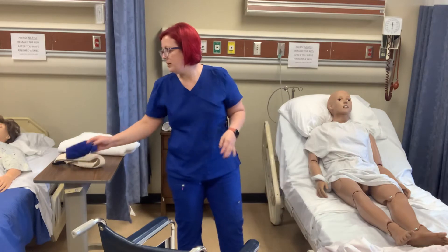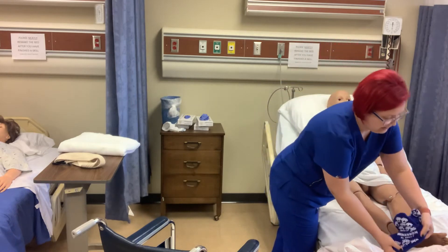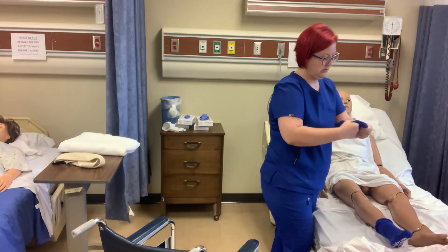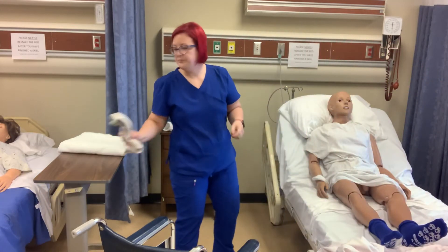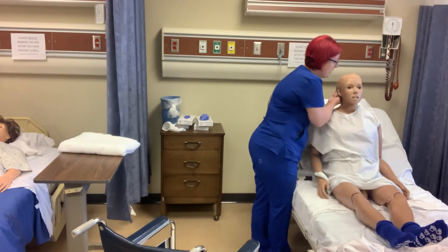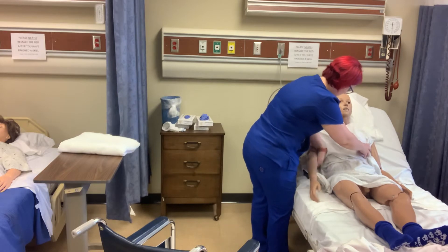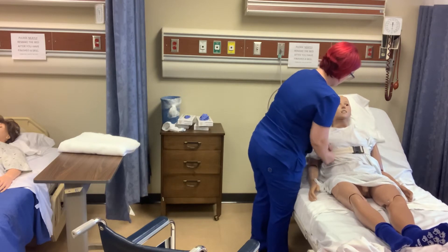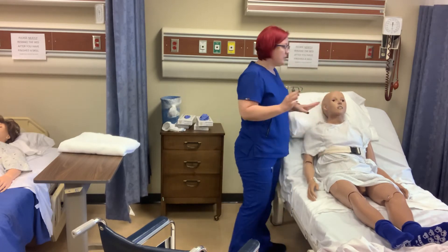And I'm going to put socks or shoes — non-skid footwear — on him. And I'm going to put his gait belt on him. I'm just going to ask him to sit up a little bit for me and I'm going to slide this behind his back and we're going to buckle it, leaving enough room that we can still put our four fingers underneath it. This is a critical step.